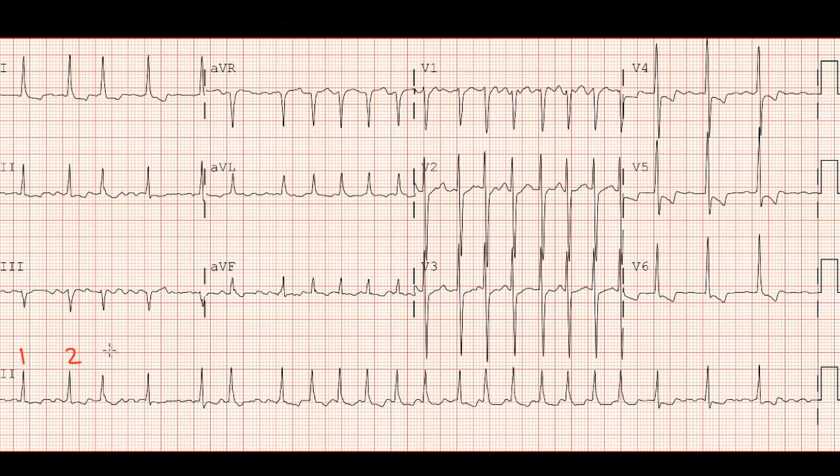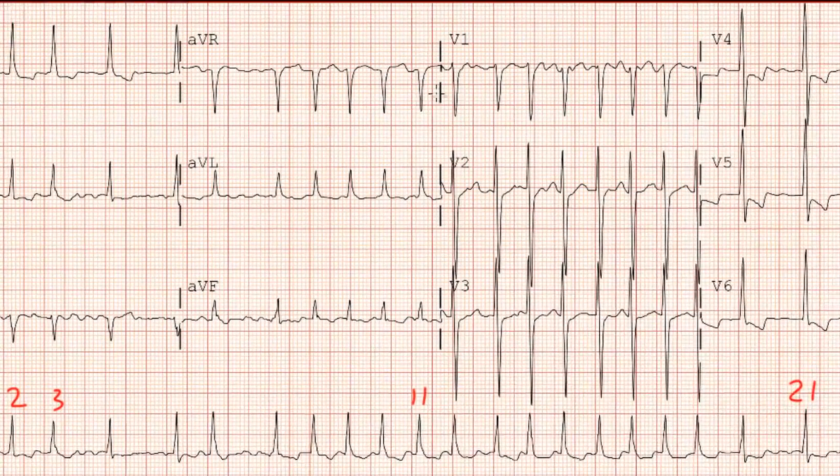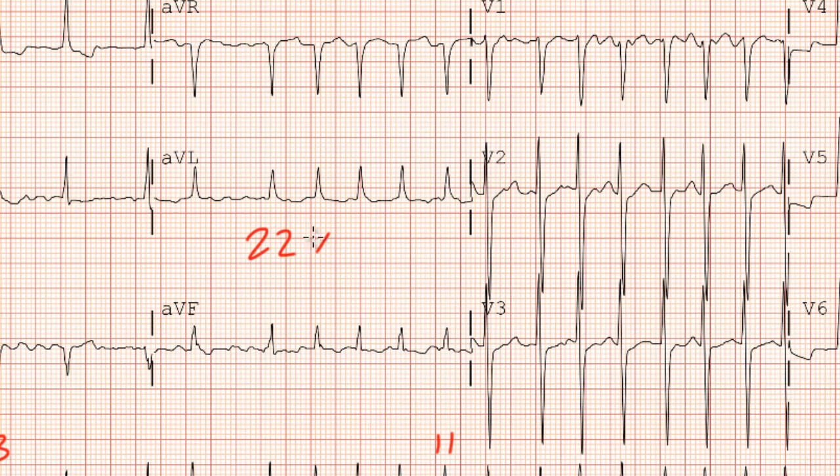We got 1, 2, 3, 4, 5, 6, 7, 8, 9, 10, 11, 12, 13, 14, 15, 16, 17, 18, 19, 20, 21, 22 QRS complexes on this 10 second EKG tracing. That means our heart rate is 22 times 6, or 132 beats per minute. Okay, now I'm just showing off.